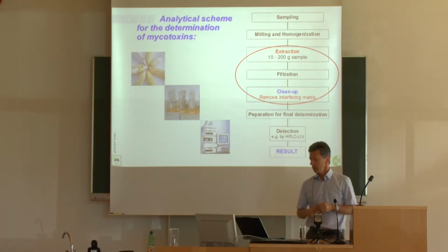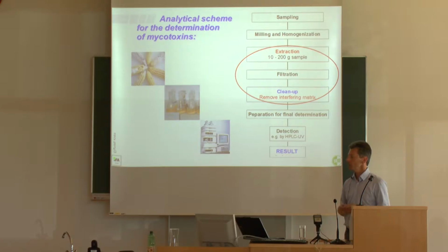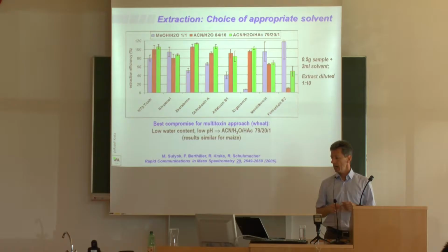Well, the next step after proper sampling and homogenization in the analytical scheme for determination of mycotoxins is extraction, filtration, and cleanup. And that is what I will dwell on in the next 15 minutes or so, I guess. Let's talk about extraction first.